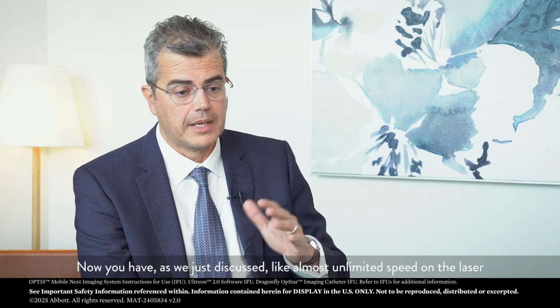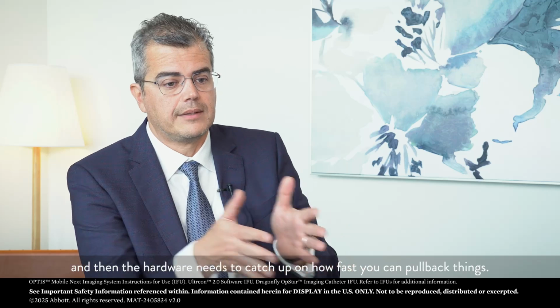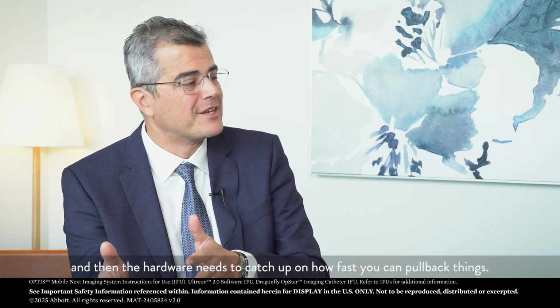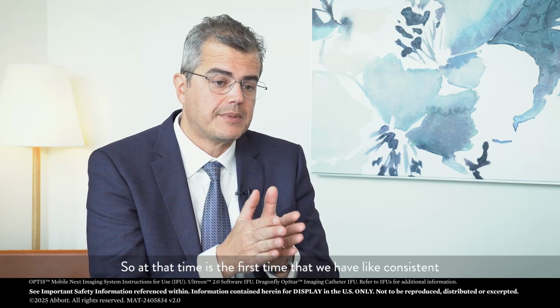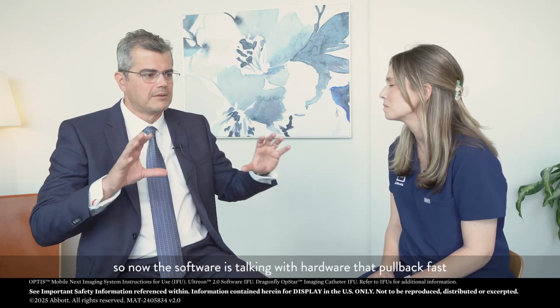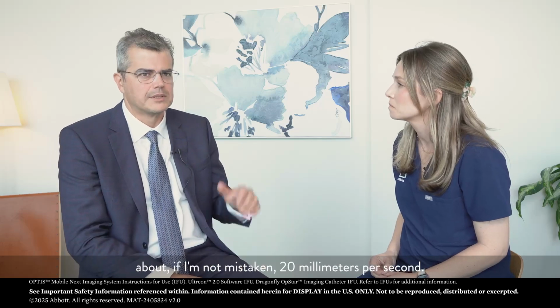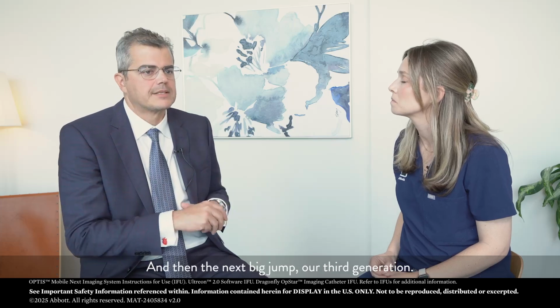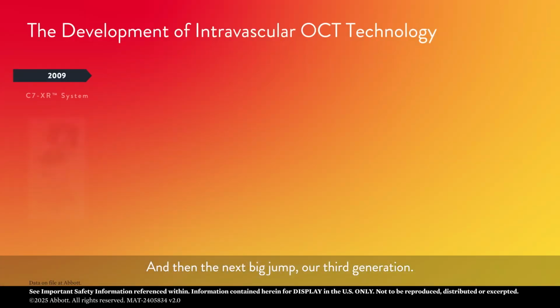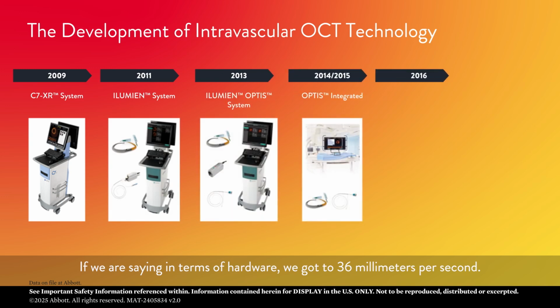Now you have, as we just discussed, almost unlimited speed on the laser, and then the hardware needs to catch up on how fast you can pull back, right? So at that time is the first time that we have a consistent longitudinal view of the vessel. So now it is software talking with hardware that pulls back fast, about, if I'm not mistaken, 20 millimeters per second. And then the next big jump, or third generation, in terms of hardware, got to 36 millimeters per second.